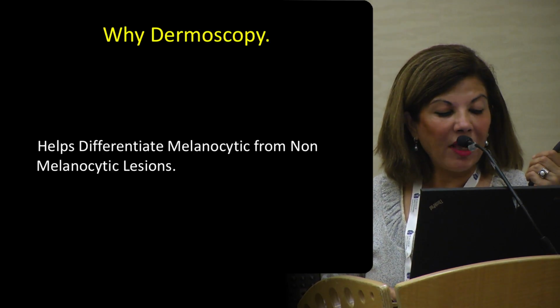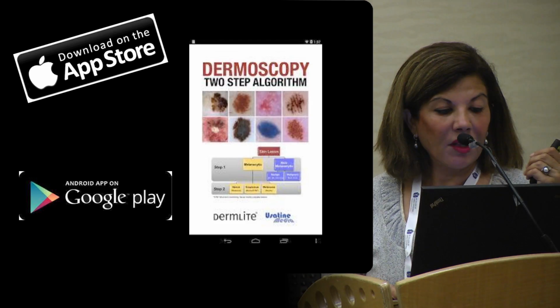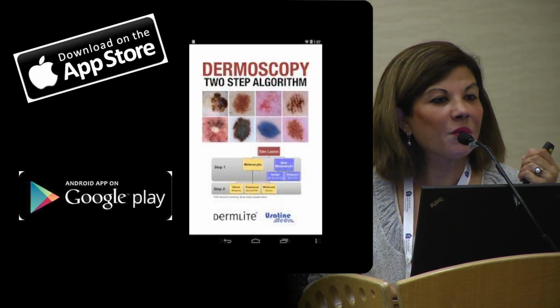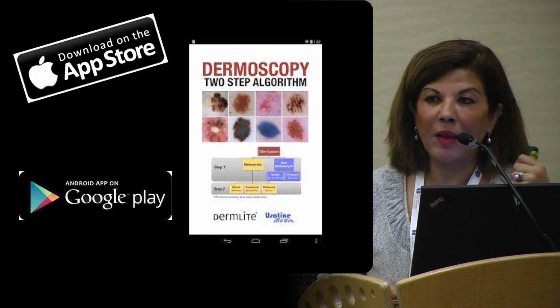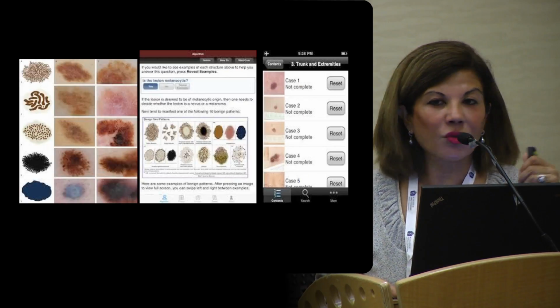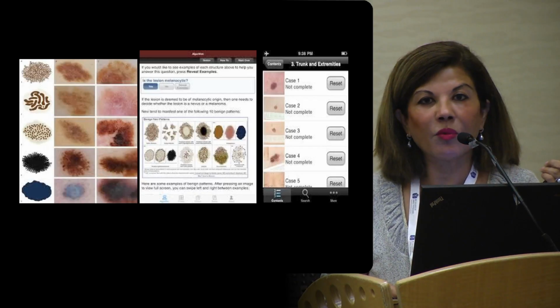So dermoscopy will help to differentiate melanocytic from non-melanocytic lesions. I'm happy to report that the dermoscopy two-step algorithm I've just presented to you is now downloadable on the App Store. And you can see all the structures, you can go through some clinical cases, and it'll take you through this algorithm in a stepwise fashion.